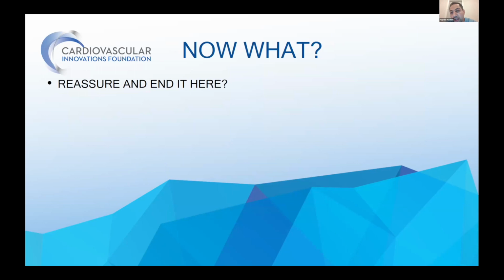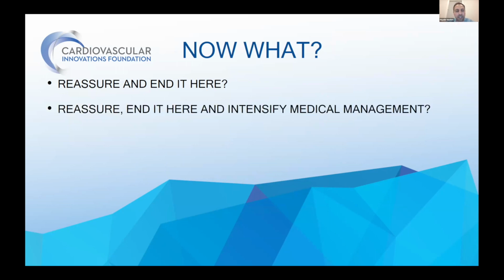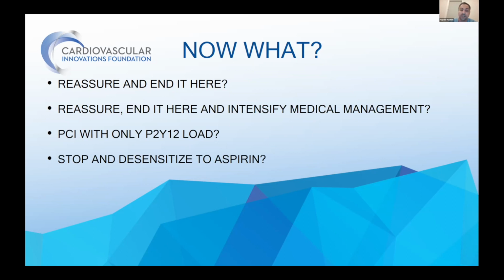Now we have the FFR. And do you say, you know what, your FFR, your resting was fine, your hyperemic was right there, 0.76. Some trials talk about 0.75. I'm going to leave you here. Now I know what your lesion is, but I'm going to add more medications to you. Or do I have enough data now to put a stent in you? But if I put a stent, you are anaphylactic to aspirin. Now what? Would you proceed with PCI, giving him P2Y12 load? Would you stop and desensitize to aspirin?